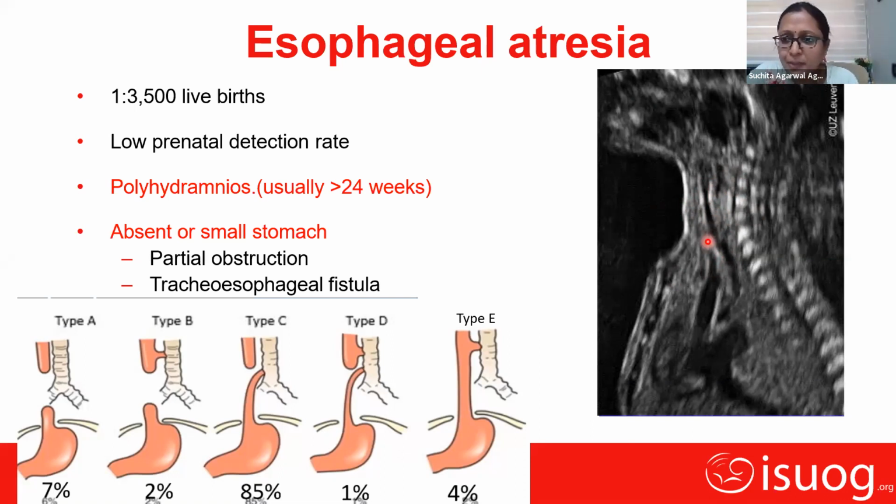So that's all. I haven't prepared much, sir, about this. Yeah, you are pointing to the trachea, right? Yes, and lower down is the esophagus, and the fluid collects there, and it forms a pouch-like thing actually.